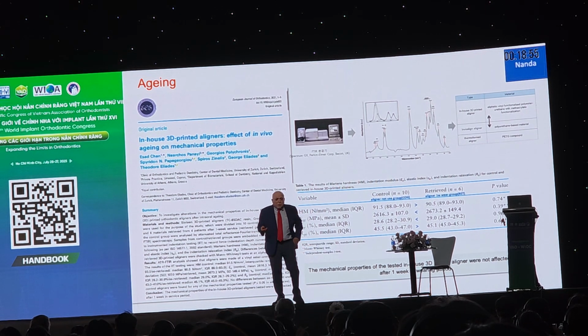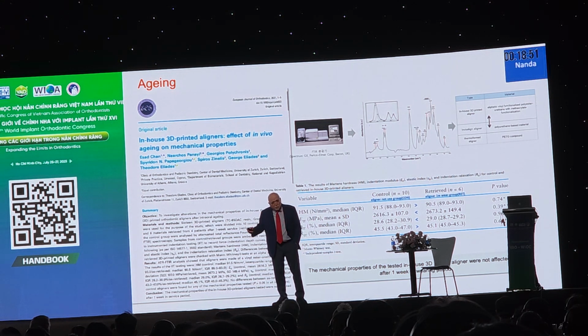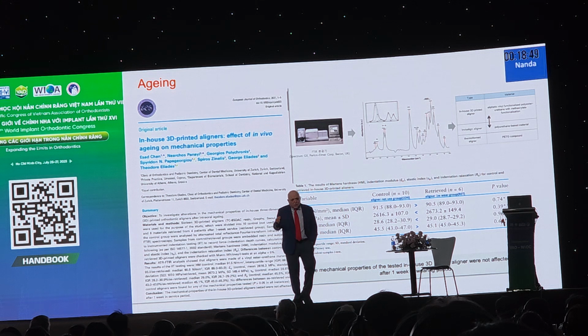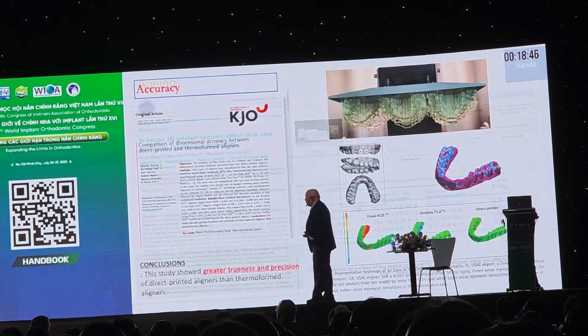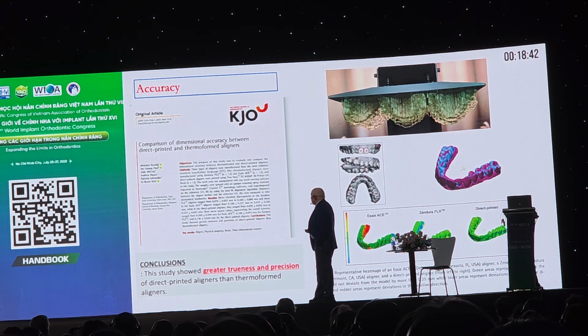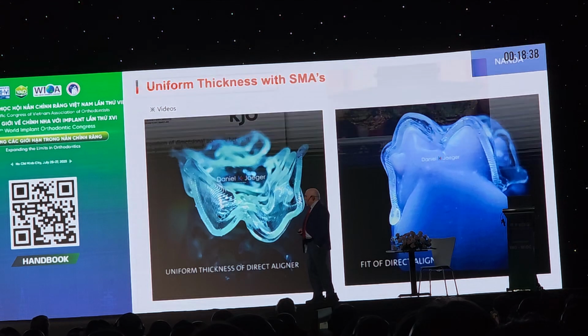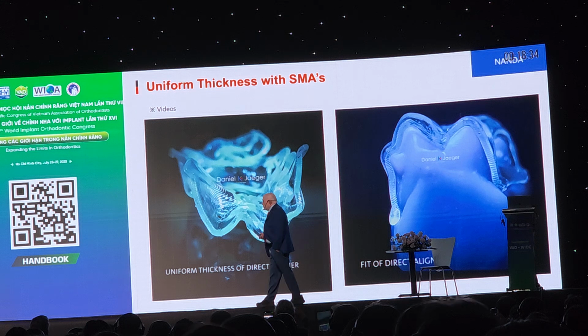So I'm not saying something just to impress you. These are all evidence-based studies. I never talk about anything if it is not in the literature or we have not studied it ourselves. This also talks about accuracy between direct printed and thermoformed aligners. It also comes from Dr. Kim's office. This also talks about uniform thickness.